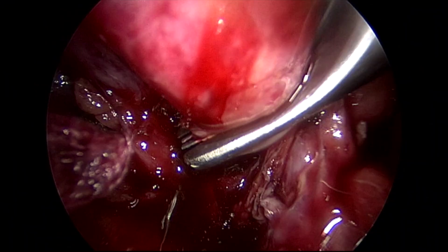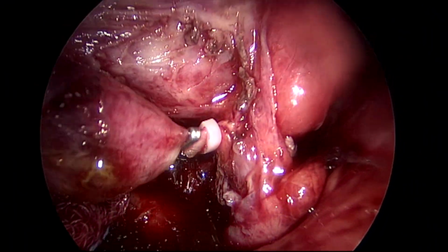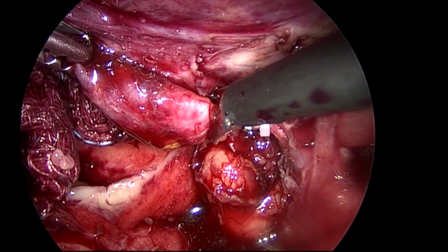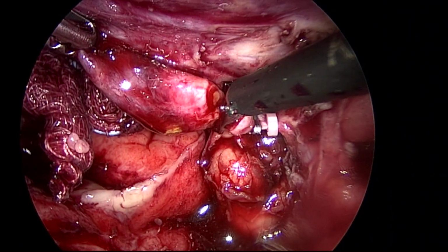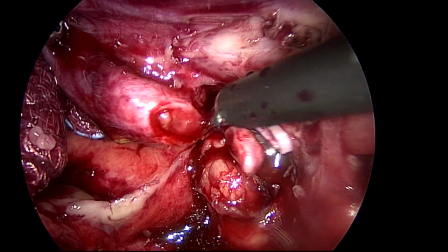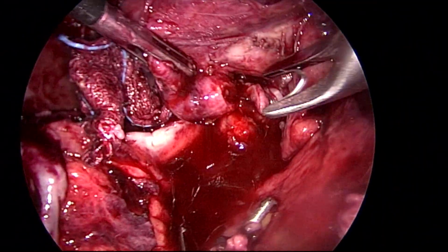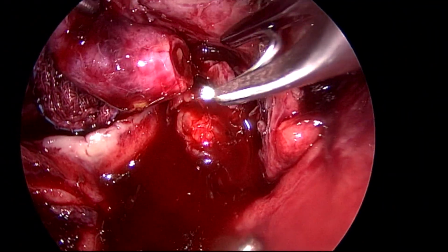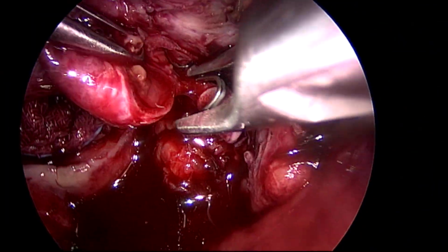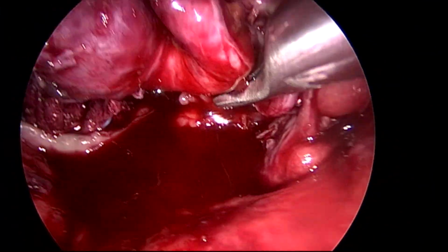Separate the omentum, go down close to the GB wall, find the infundibulum, and then separate the infundibulum from the surrounding structure. You can see the cystic duct. Now the infundibulocystic junction is being divided. Basically the cystic duct is clipped, doubly clipped. I am not leaving any tissue, and this is a widened infundibulocystic junction. So I am just clipping that area and dividing it.